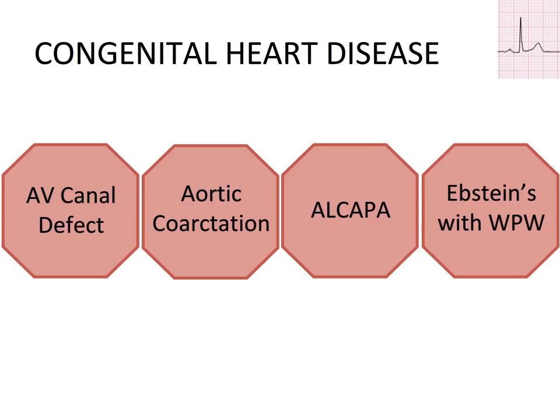We hope that you are now more comfortable recognizing some key EKG findings of congenital heart disease. Remember that if you are concerned about any of these findings or conditions, you should consult cardiology for further workup and management. As always, we welcome your feedback and suggestions. Thank you for completing this module.